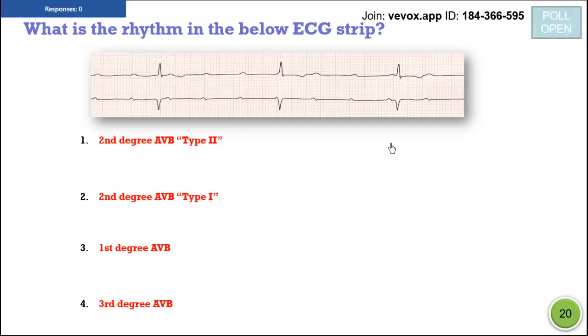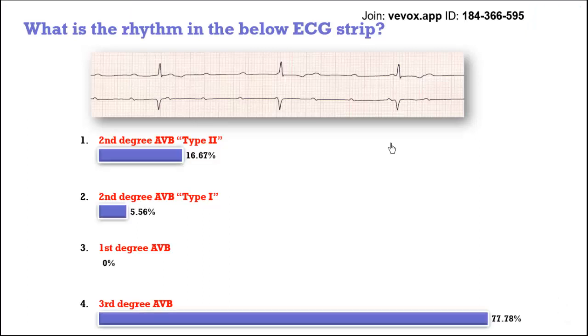Go. 8 people, 13 people, good. We have bradycardia, extreme bradycardia. A pacemaker has to be inserted at once. Immediate shift to the cath lab, please, for a pacemaker. So most of the people said third degree, which is the correct answer.